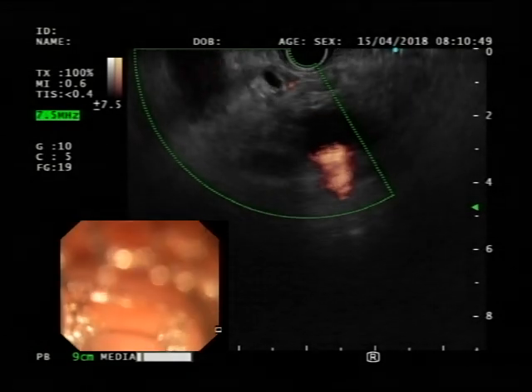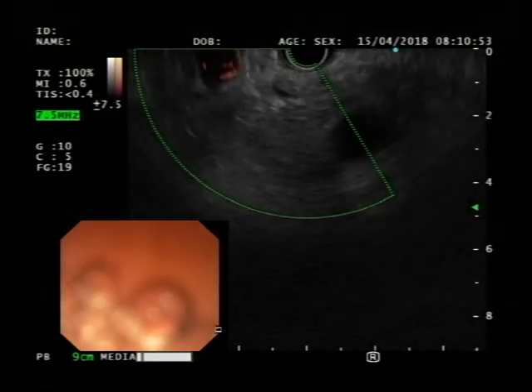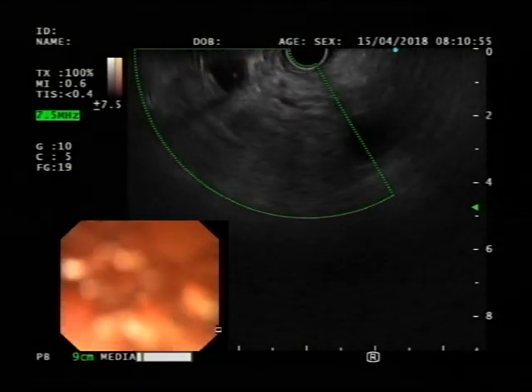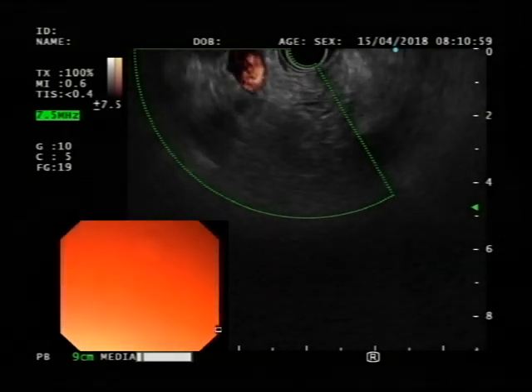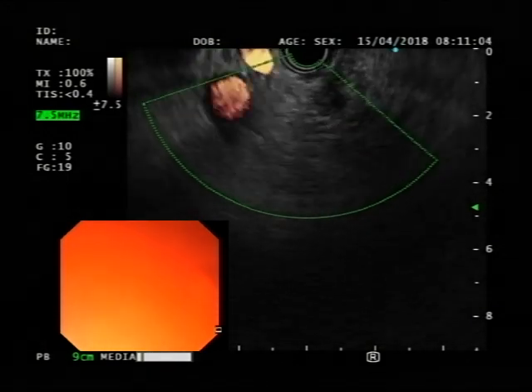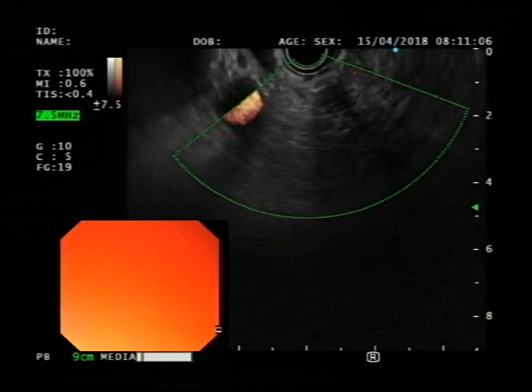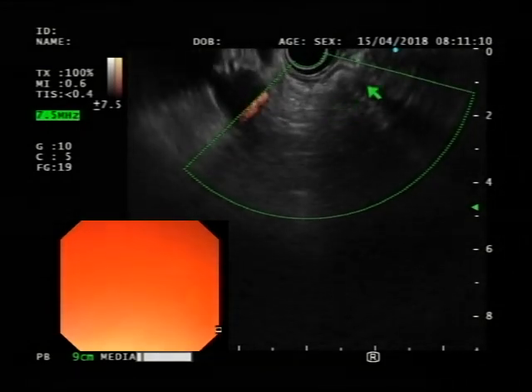Big wheel towards you, yes, and start rotating it to the right. Okay, without losing that. Without losing that. Keep going, keep going. Good, good. Keep going. Yeah. So it's starting to disappear in that area. So there's something in this area.